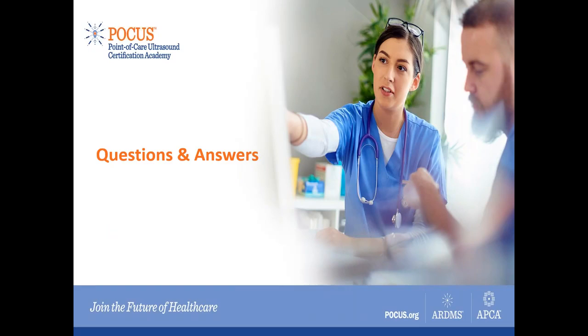Thanks. Thank you. Another one that came in that I think is interesting is, how can I be sure that the blood vessel I'm measuring is truly the abdominal aorta? If you're in doubt, you will be able to see the layers of the wall of the abdominal aorta: the intima, media, adventitia. But if not, you may see plaques, you may see pulsatility, but you can use spectral Doppler. You can put the cursor right on that vessel in the middle of the lumen, and you will see an arterial waveform, which is very different from venous.